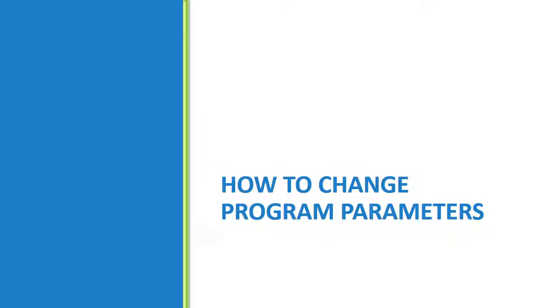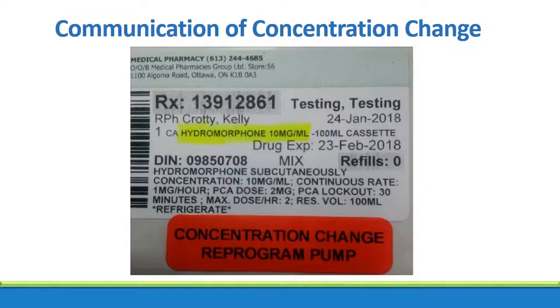Next, we will go over how to make changes to the pump programming for patients already receiving therapy via the CADD Solis pump. When there is a change of concentration, the pharmacy will affix a label on the container advising the clinician to change the concentration and reprogram the pump. Do not let this change the validation process. The pharmacy has put multiple safety checks in place to ensure that changes are highlighted, but you, the clinician, are the last licensed healthcare provider between that drug and the patient and are accountable for performing your rights of medication administration.